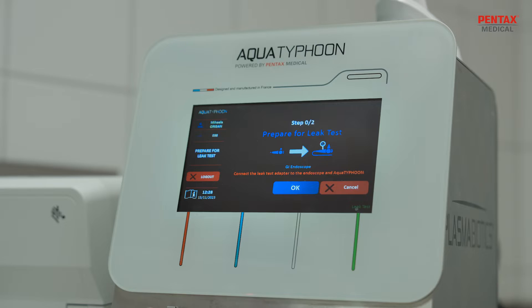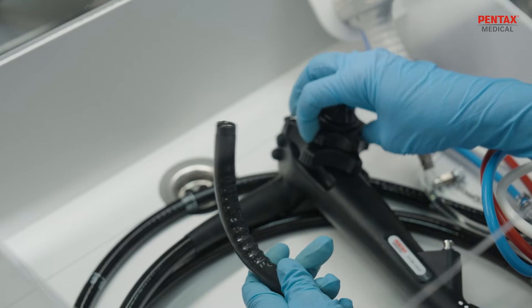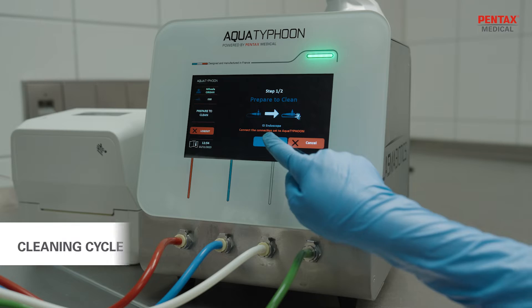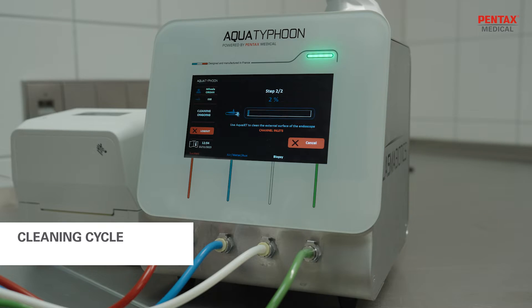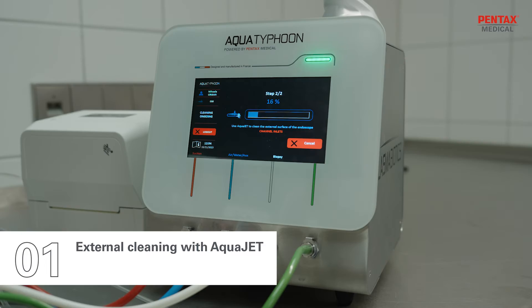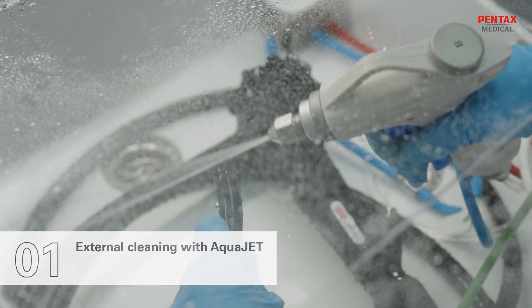The first step consists in performing the endoscope leak test. Then the operator starts the cleaning cycle. Aqua Jet is used for external cleaning of the endoscope, channel inlets, endoscope body and distal end.